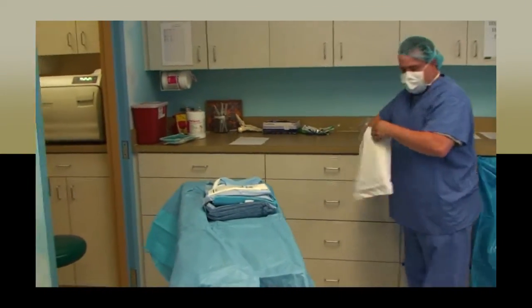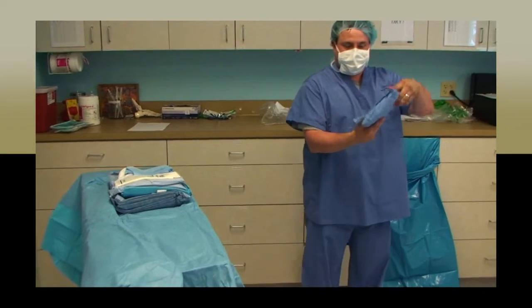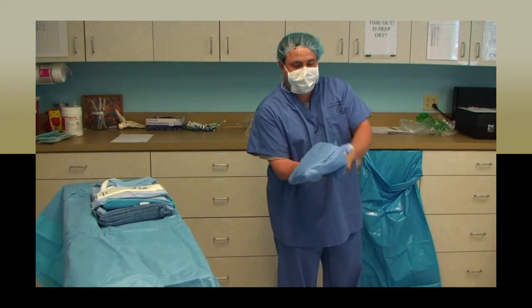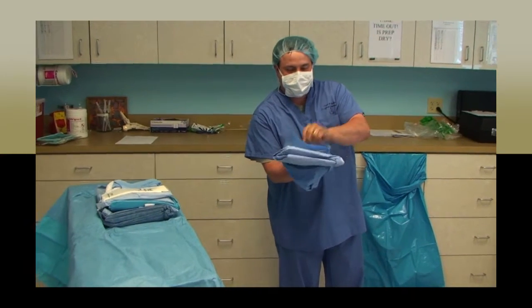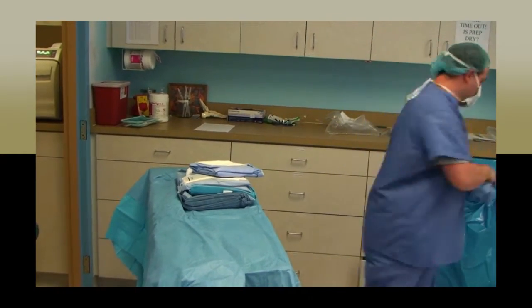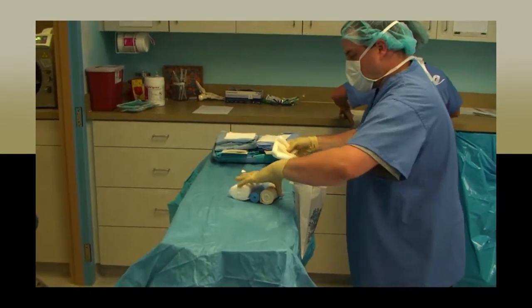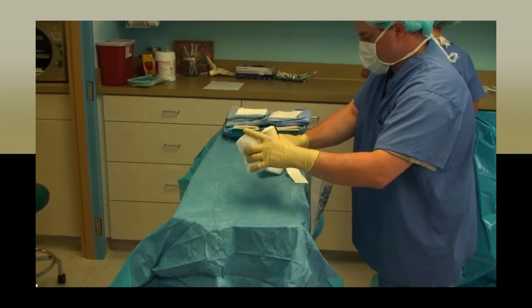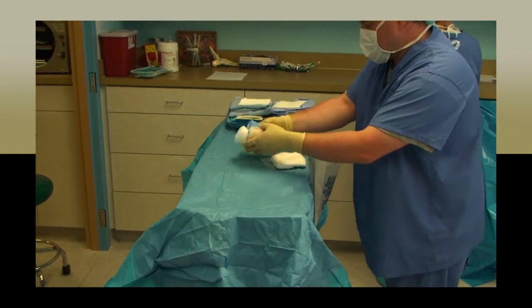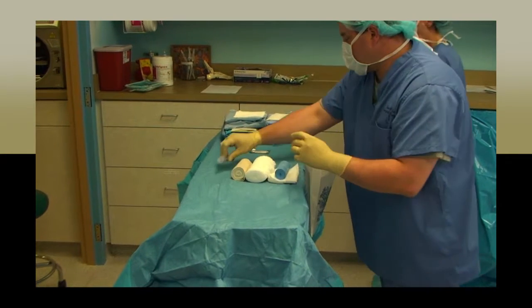After you have opened your sterile field and the contents are sitting sterilely on the field, you will need to pass other instruments and materials to the field. This must be done using an aseptic technique which will keep things from being contaminated. It is important while in a surgical center to develop a watchdog personality. We are all working hard to ensure each item remains sterile. However, mistakes occur. Fields are contaminated, walls are bumped, and it is our job to watch for these things and call them out so we can replace the contaminated item with a sterile one.